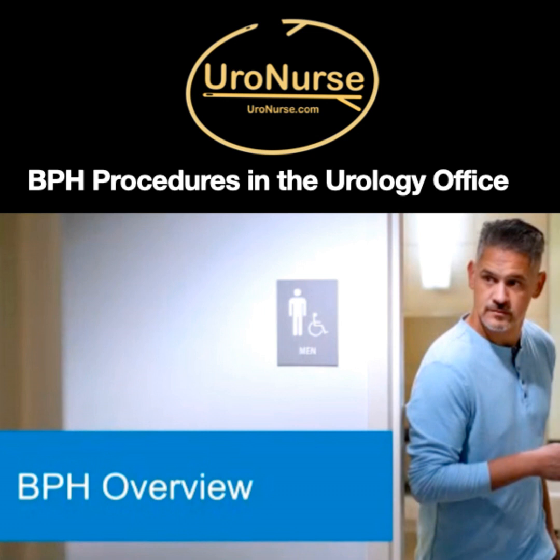And so as you can see here, there's a pretty decent retreatment rate. This study, they're quoting a 13.6% surgical retreatment rate at 5 years. Now the Urolift people are going to dispute that. They've got different studies showing it's a bit lower than that, and it probably is a bit lower than that.